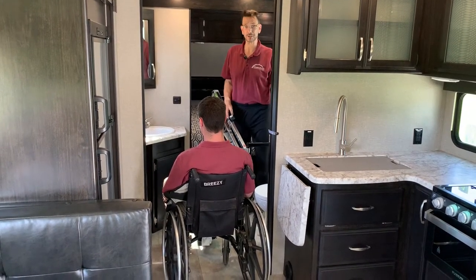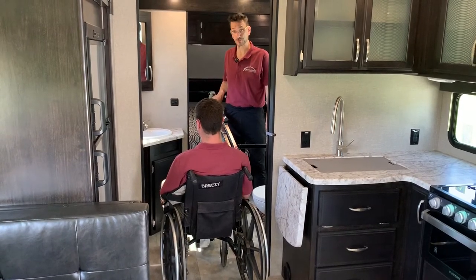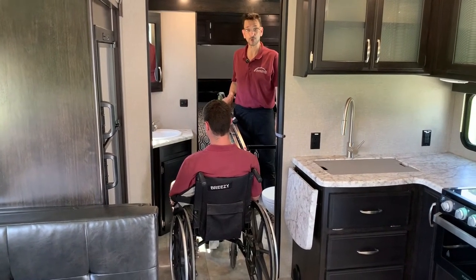Hi and thanks for tuning in to Access Unlimited's YouTube channel. Today we'd like to introduce you to the Multilift personal transfer lift system, shown here for use inside of a travel trailer RV or motorhome.